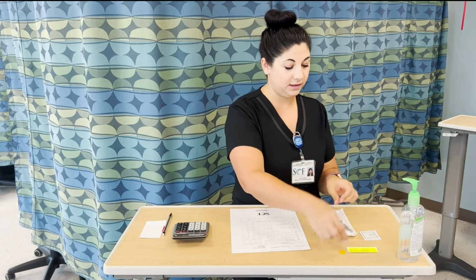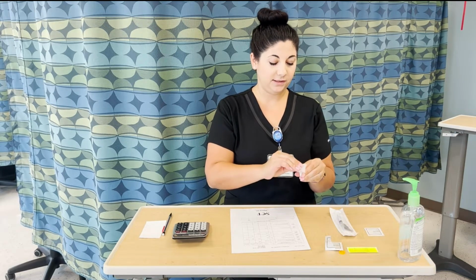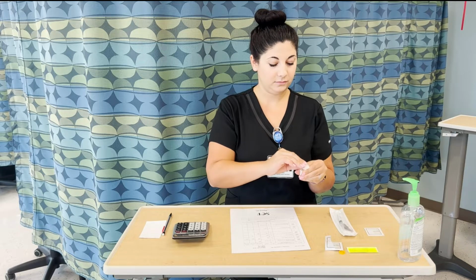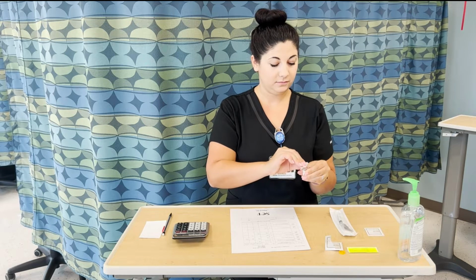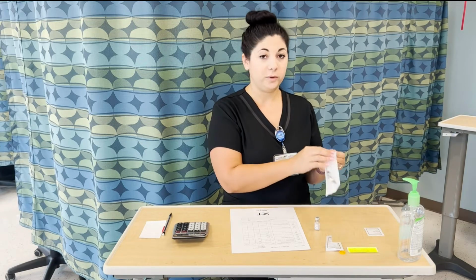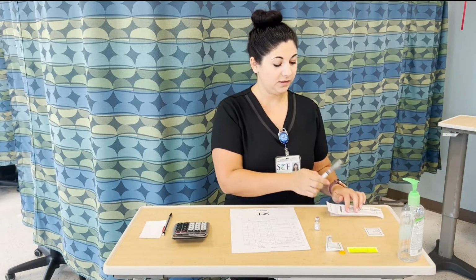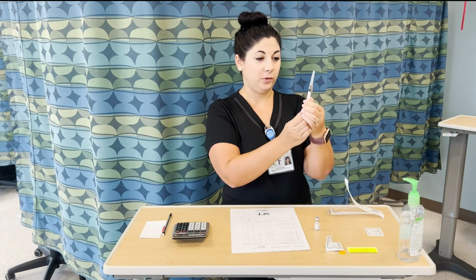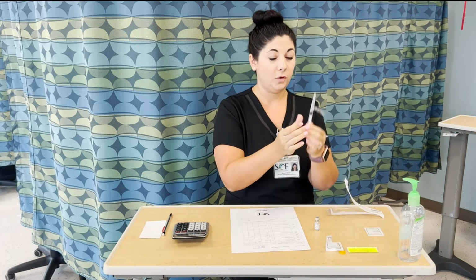I will pop off this dust cap and clean the top vigorously for 15 seconds. While that's drying, I can open my syringe and get that ready. I am using a 22 gauge 1-inch needle. I'm going to pull air to 0.5, holding it right at eye level.